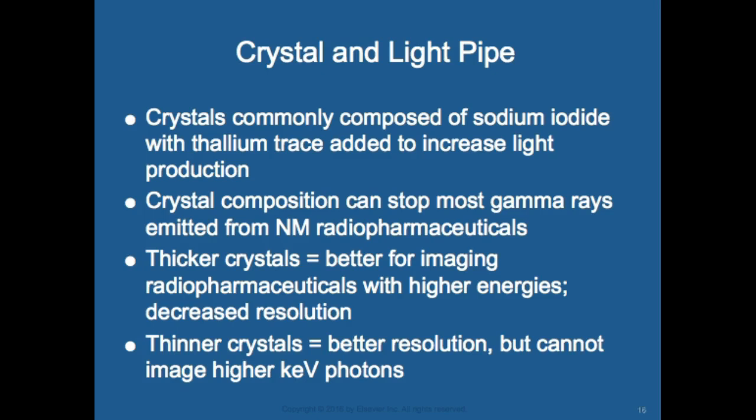So, the crystals and light pipes. Crystals are commonly composed of sodium iodide with a thallium trace added to increase light production. Crystal compositions can stop most gamma rays emitted from nuclear medicine pharmaceuticals. So the thicker the crystals, the better they are for imaging radiopharmaceuticals with higher energy, but you lose your resolution.